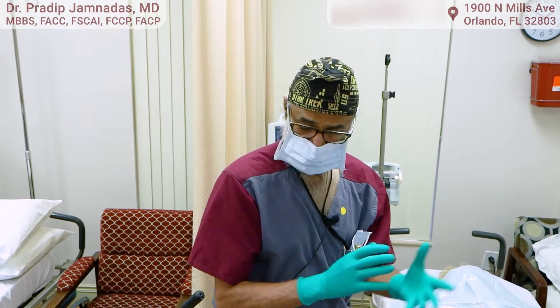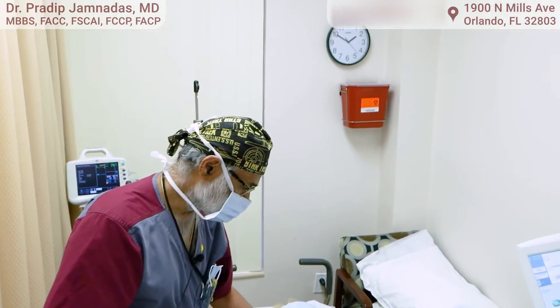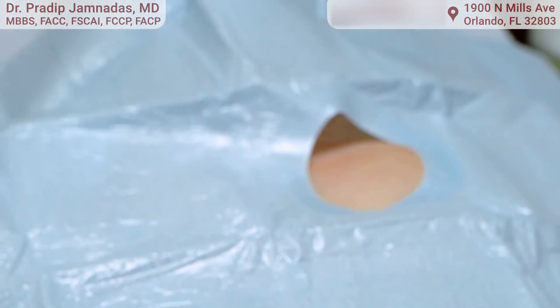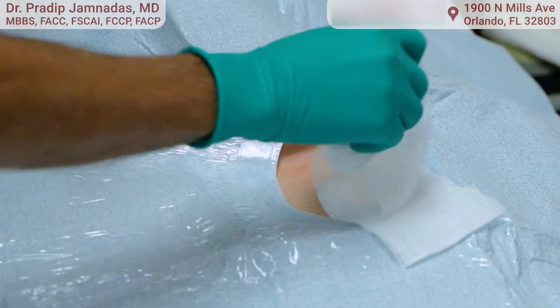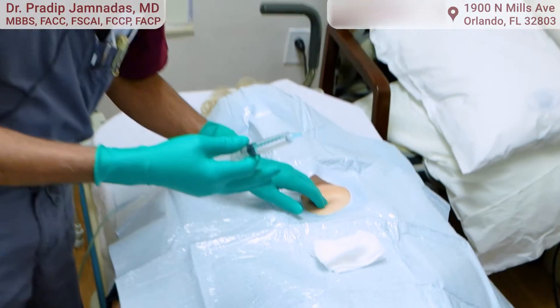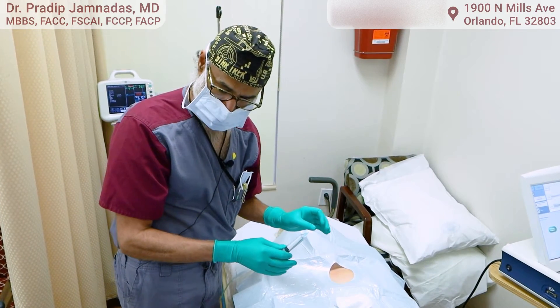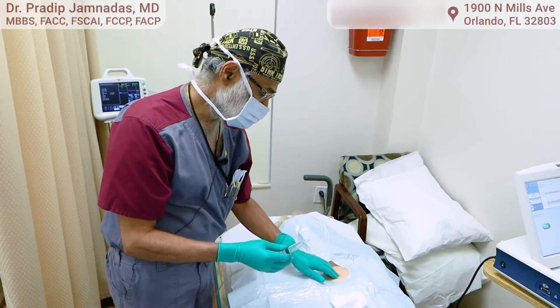We're about to put in a loop recorder in a patient. This is a very simple procedure done in the office setting under local anesthesia and sterile conditions. This procedure is well suited for patients who are having blackouts, atrial fibrillation, or we think they're having atrial fibrillation. We want to know whether they need to continue taking blood thinners, what arrhythmias they're having, the cause of a stroke or blackouts. This monitoring device will detect the exact arrhythmia the patient is having.